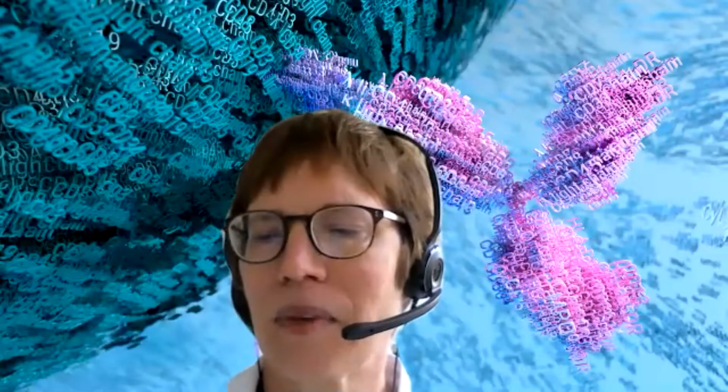And the rotors, if you place them in a wash centrifuge and they turn clockwise, you can sediment the cells and pellet them. And then the centrifuge can stop, turn counterclockwise. And then the buckets for the tubes arrest and give an outward tilt. So if it's turning counterclockwise, you can discard all the fluid, keep the pellet. And so you can really do washing 24 samples at once. This is really saving a lot of time, really making the system quite fast. Right. Okay, thank you.